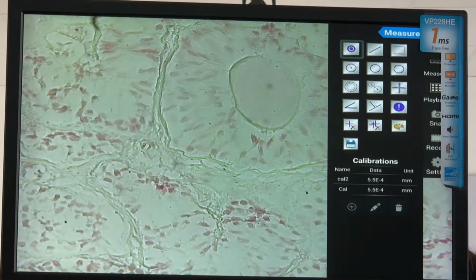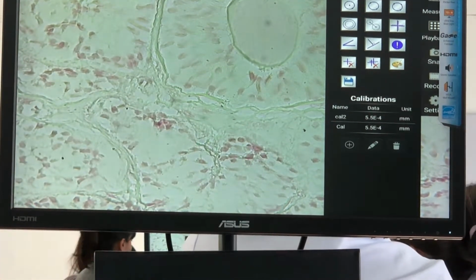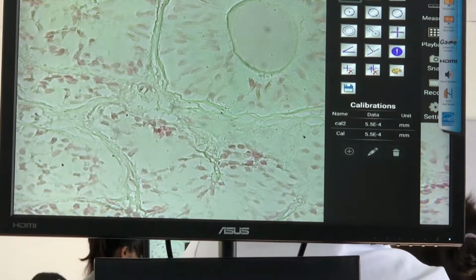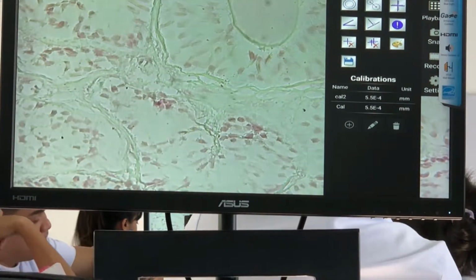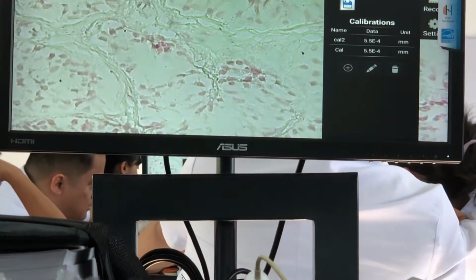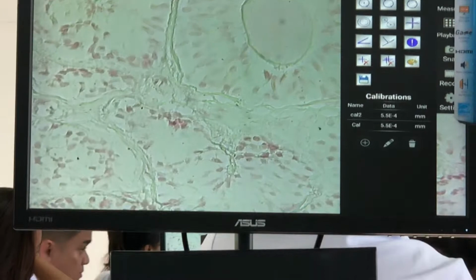with respect to their importance in the biopsy, when you become a pathologist, or hopefully end up being a pathologist someday, these slides have some important autopsy and biopsy value. So like this slide number 85, atrophy of the testis. All you need to see is what is your basis for it to be a testis.